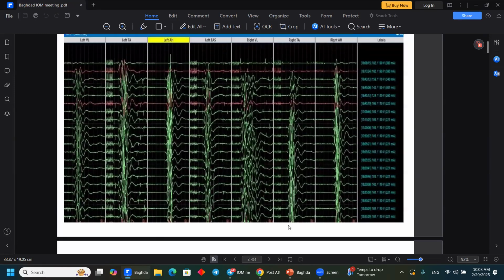It was found that stimulating the anesthetized patient's skull with a high density current can stimulate the cortical neurons, and subsequently the stimulation volley can be transmitted through all the motor pathway and recorded from the muscle. And this is the base of motor evoked potential. Stimulation of the cortical neuron, recording from the last part of the motor system, which is the muscle.